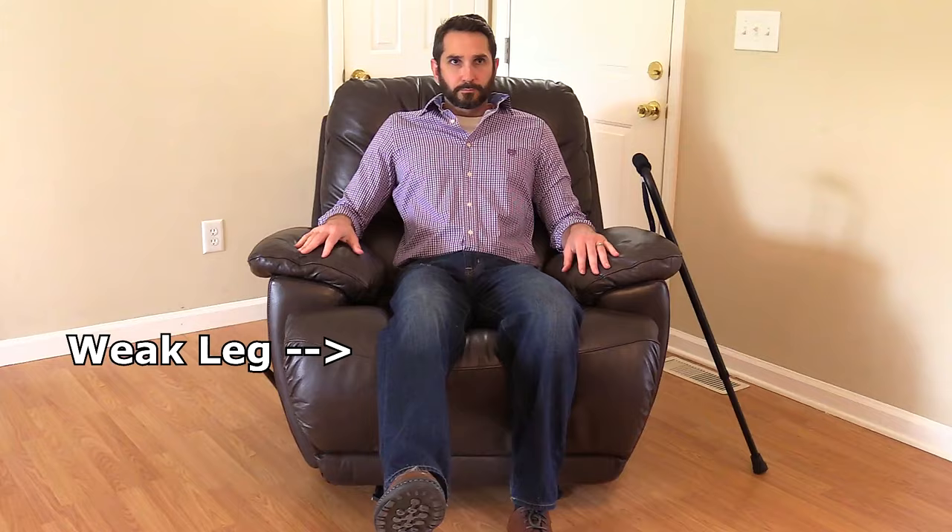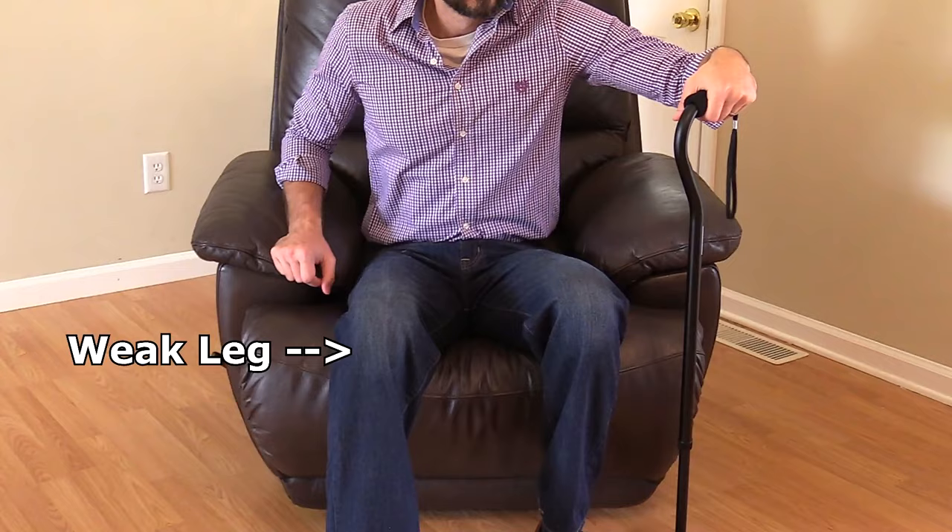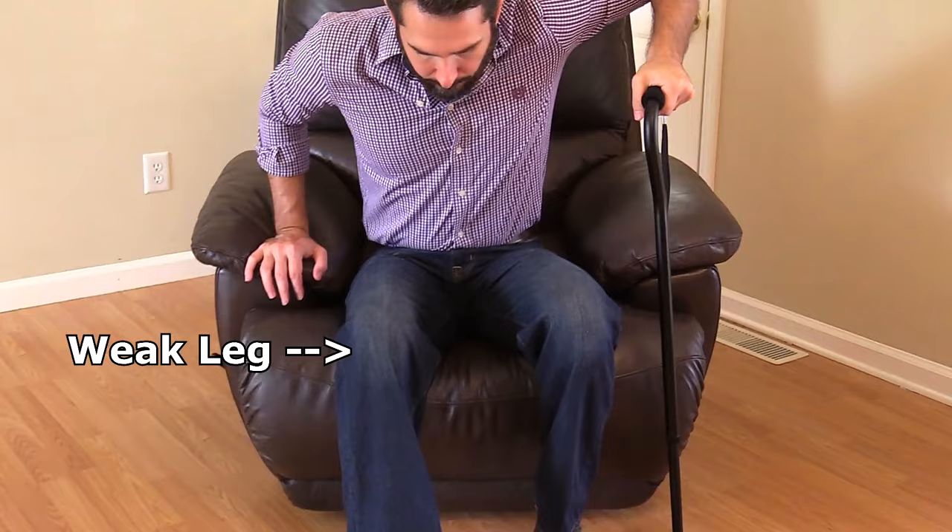To get up with the cane, the patient places the cane on the strong side and leans forward in the chair while keeping the weak leg slightly extended forward. Then the patient pushes down on the cane's hand grip and the chair armrest, puts weight on the strong leg, and stands into position with the cane.